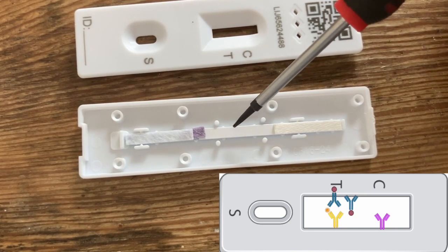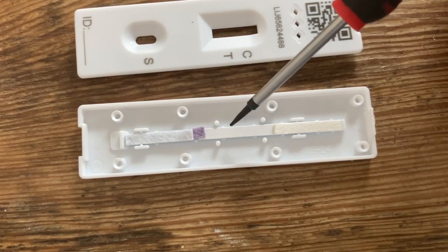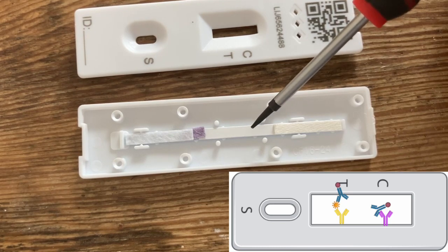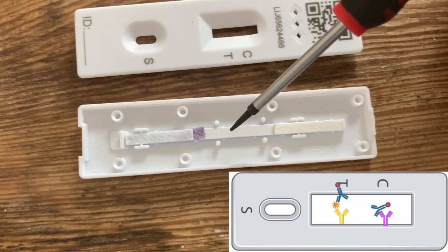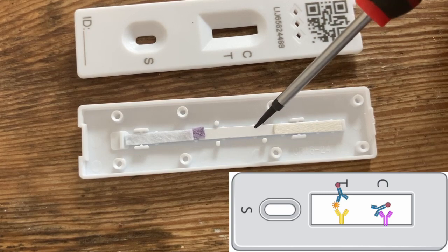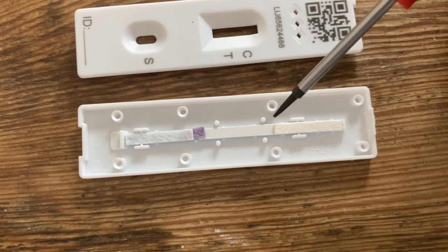So if you're testing positive, you'll get a red line appear there, because that's where the trapped antibodies will sit. Now these things just carry on until they get to the control line. This just basically indicates that the test is working — any of the antibodies that didn't get stuck at the T line now get stuck there. And then anything remaining carries on to the pad at the end.